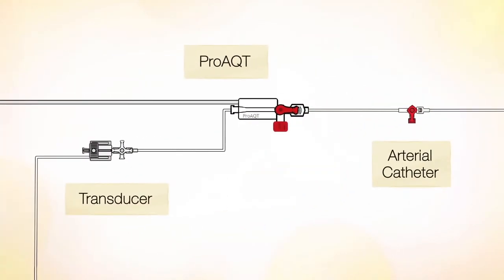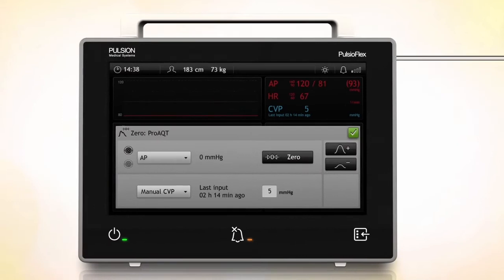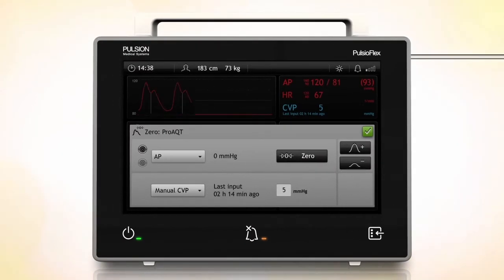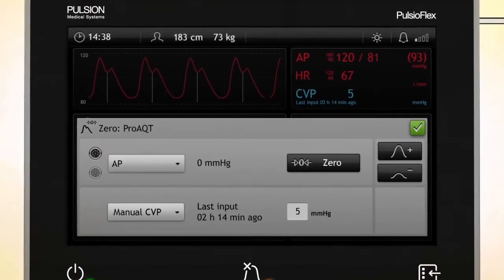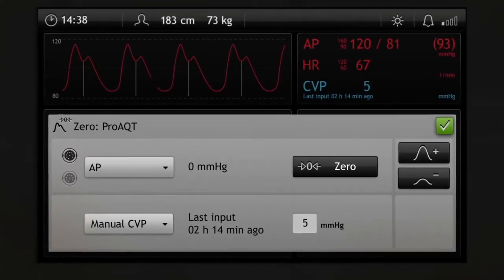Close the arterial system for the measurement. The pressure curve reappears on the monitor. Finally, enter the current CVP for SVRI calculation. When you're finished, close the window by tapping the check mark.